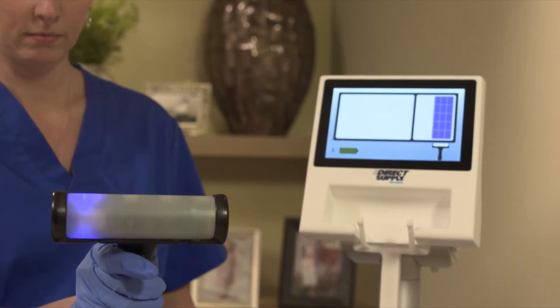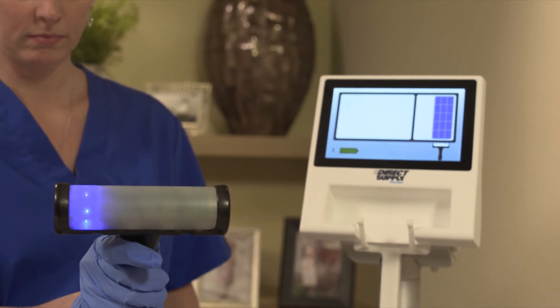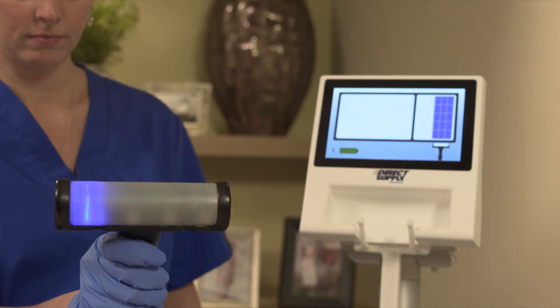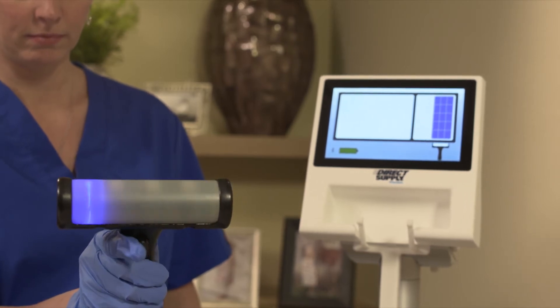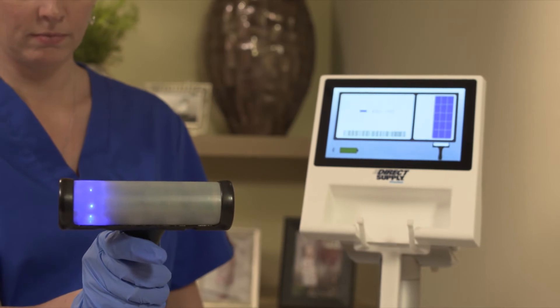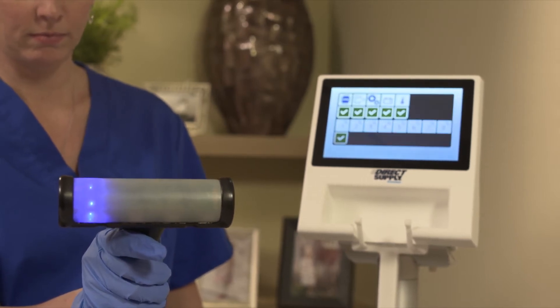To help ensure the Attendant Prodigy Bladder Scanner is operating correctly, you can perform a self-diagnostic test. Hold the scanner probe, which should be clean and not in contact with any surface, and complete five air scans with a full two-second pause between each successive scan. The console will then display the results of the self-diagnostic routine.